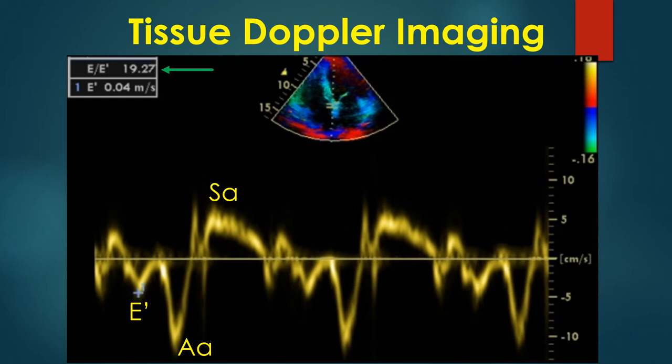The high E by E prime ratio in this case indicates left ventricular diastolic dysfunction. E by E prime at the lateral mitral annulus more than 10, and E by E prime more than 15 at the septal mitral annulus, indicates left ventricular diastolic dysfunction. E by E prime values less than 8 would indicate normal left ventricular diastolic function. The yellow tracing is pulsed wave tissue Doppler imaging.